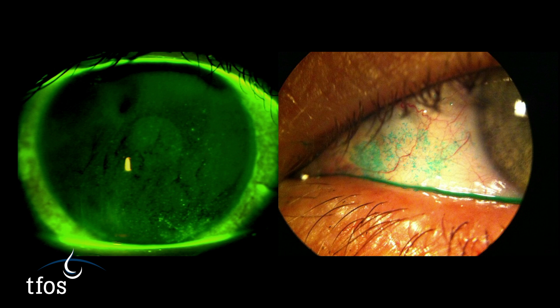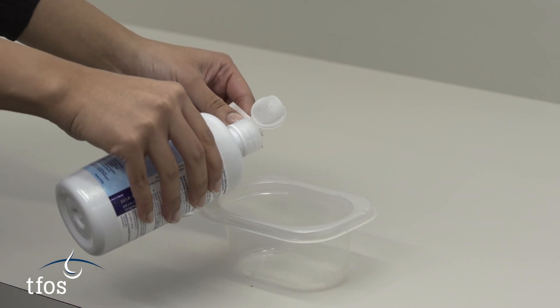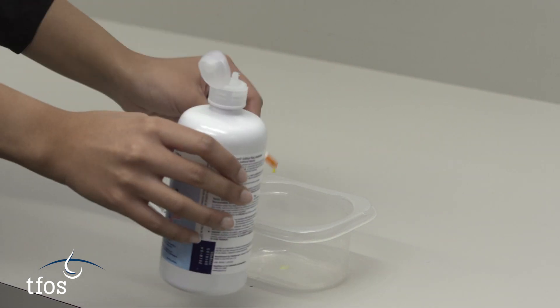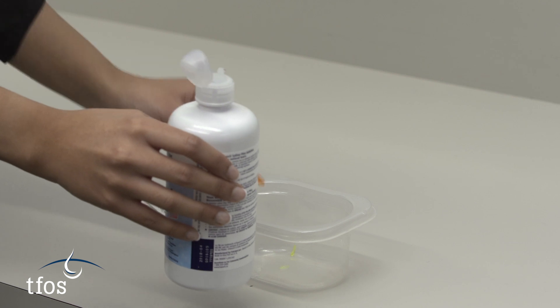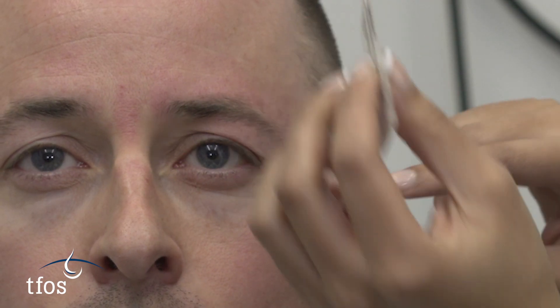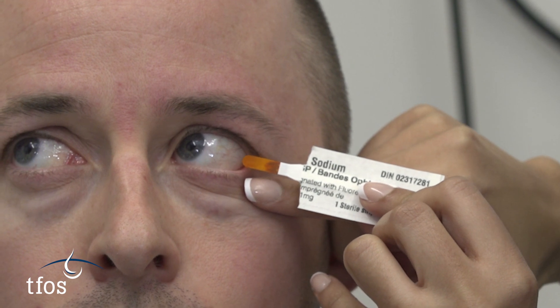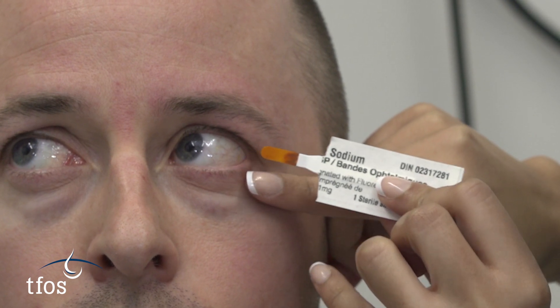Corneal damage is best highlighted by fluorescein. A saline drop should be placed on a fluorescein strip without contact with the bottle, and the excess fluorescein flicked off. The strip should be applied flat to the temporal canthal lid margin area while the patient looks up, as this will avoid damaging the cornea, conjunctiva, and lid margin that will subsequently be assessed.